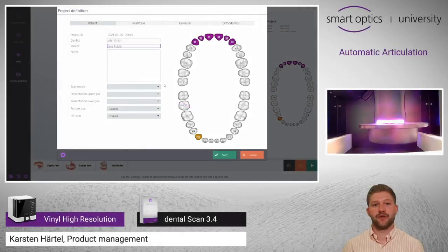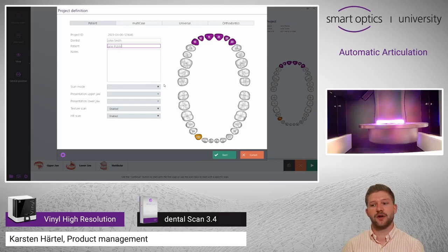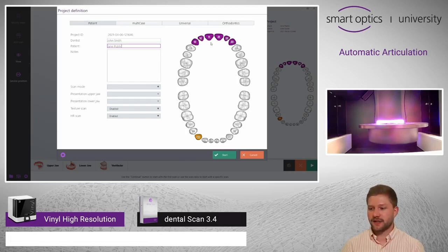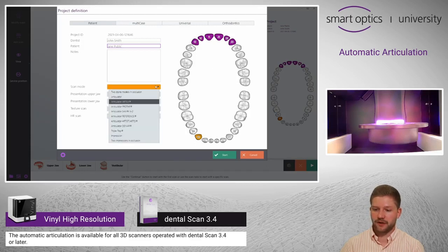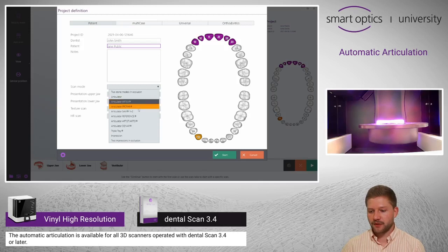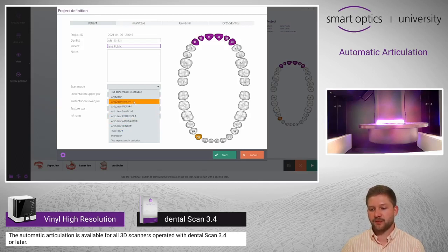This video is about the automatic articulation. With this feature, a vestibular scan is no longer needed. As you can see, I have already selected the special areas and I now enter the scan mode. By using one of these articulators, the scan files will be saved condyle related.